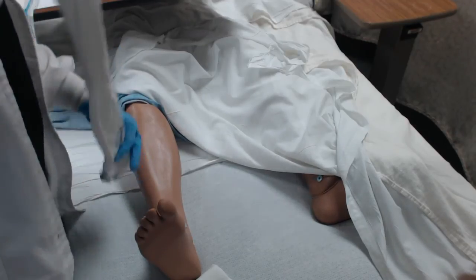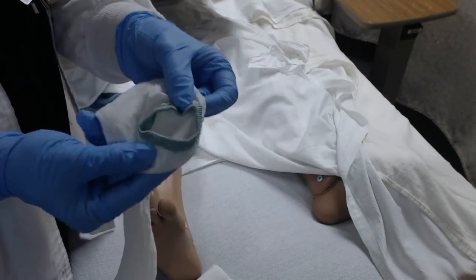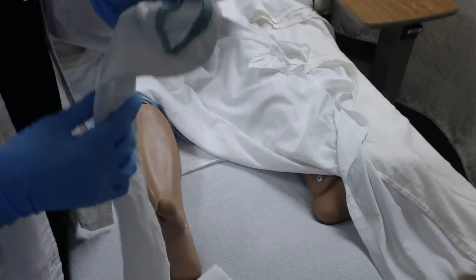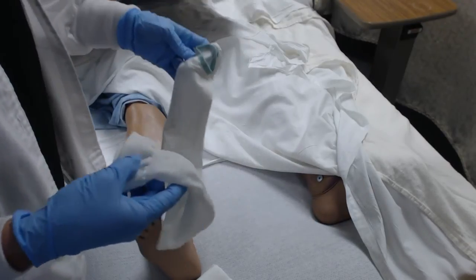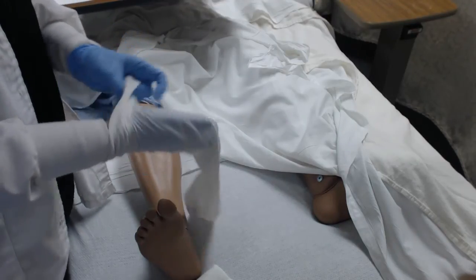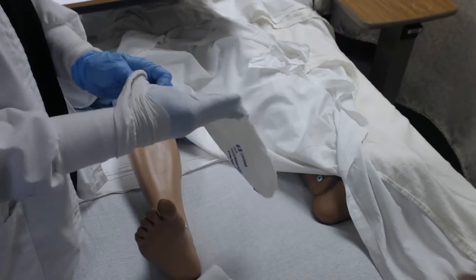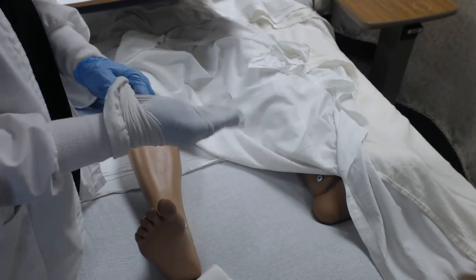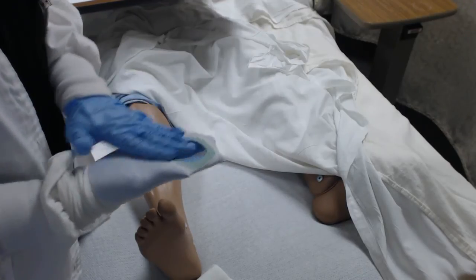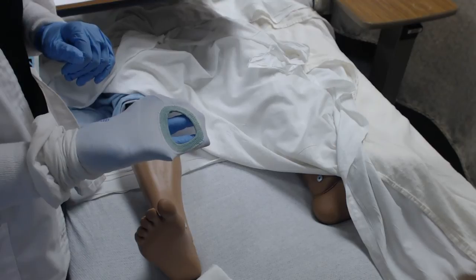Then you're going to want to open up the package, and on the very bottom of the package you'll see this hole. That's there for a purpose. What you're going to do is take your hand and insert it into the TED stocking until you get that hole on top where your palm is in your hand.